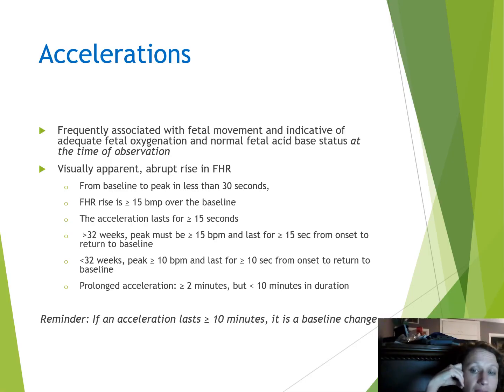We do 10 by 10s. So it's for 10 seconds and 10 beats per minute. So 10 by 10 for less than 32 weeks. And then greater than 32 weeks, you're doing 15 by 15, okay?